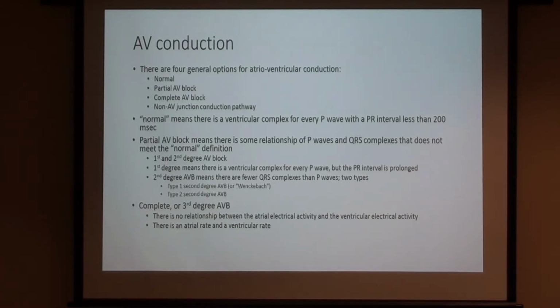Almost always, when this is present, the QRS looks really wide. There's other conduction system abnormalities. It is a pre-complete heart block sort of rhythm. You know, it just doesn't happen very much. There's almost always long PR intervals. QRS is like this wide. I mean, there's clearly a lot of conduction system disease, and this type 2 second degree block is a pre-complete heart block. It's like the next step to complete heart block.